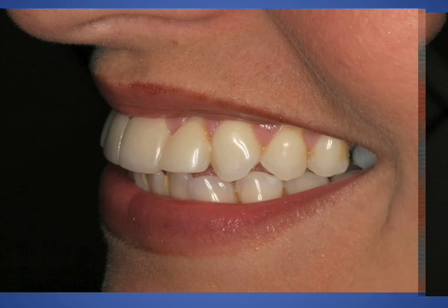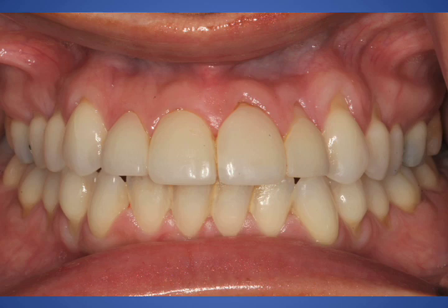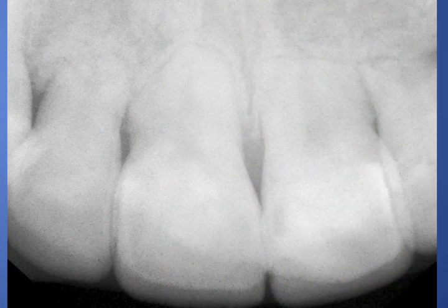Right lateral and left lateral views show an adequate smile line. We do see the triangles of the teeth, which is aesthetic. Her basic contours are not bad, but we can see a certain amount of recession along her natural dentition. Our focus today is going to be on the 4 maxillary anterior teeth, number 7, 8, 9, and 10. You can see in this radiograph that the roots have shortened immensely, creating the mobility that our patient was most concerned with.